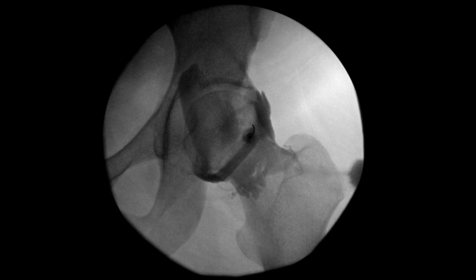Preoperative MRI with a gadolinium arthrogram is of particular utility to analyze for capsular insufficiency, as it demonstrates both capsular volume as well as egress of contrast along the location of any present capsular defects. This image shows an arthrogram in which dye has extravasated from the capsule proximally up the psoas bursa, indicating a medial capsular defect communicating with the iliopsoas bursa itself.